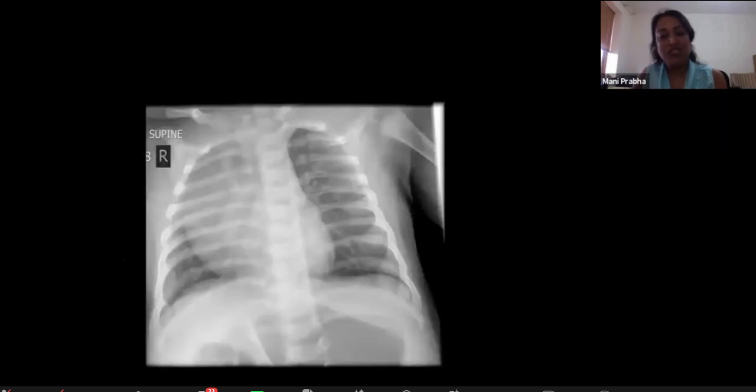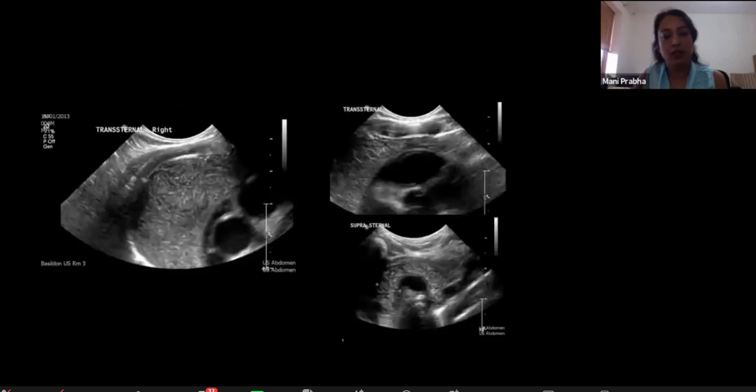So we did an ultrasound scan, as we discussed in the previous one: if there is a mediastinal pathology, ultrasound is very useful, and we really don't need to use CT in the first instance, because if ultrasound is able to answer our query, then why not use it? It's much quicker and doesn't need sedation.